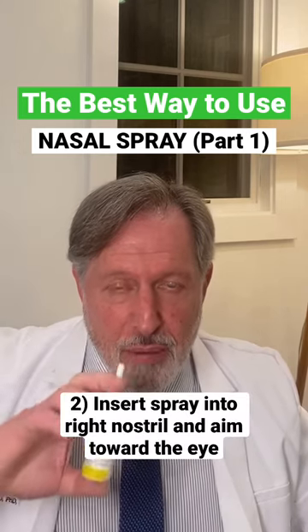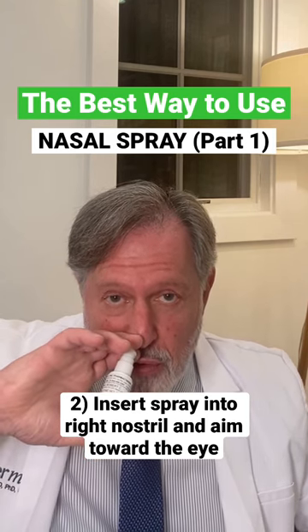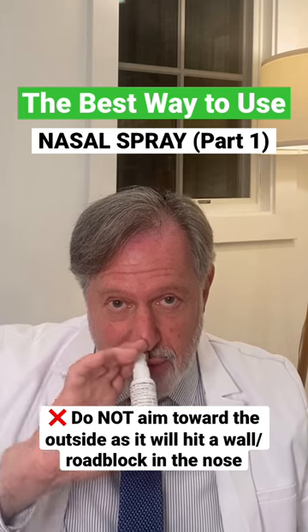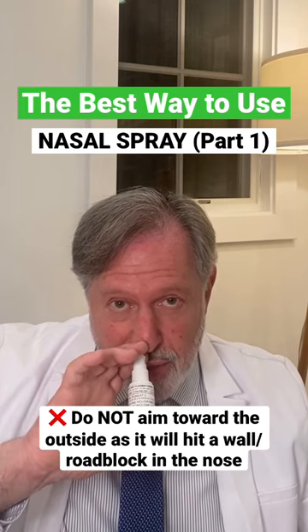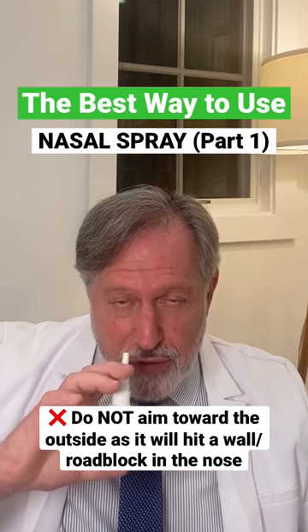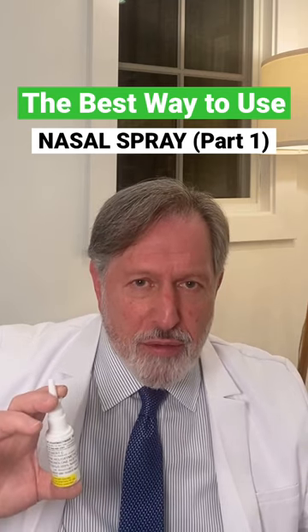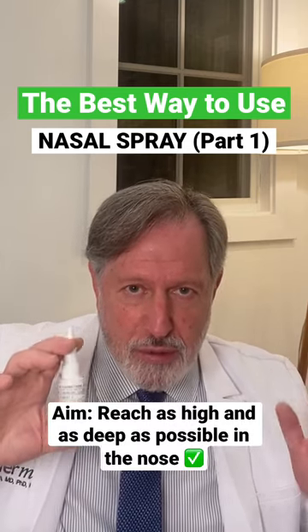I'm seated. I'm going to insert the spray into my right nostril as high as comfortable, and I'm aiming toward my eye. You're not aiming toward the outside, as you might read in the instructions of a number of nasal sprays that say to do that. In our view, doing so causes the spray to hit the wall, to hit a roadblock. Our aim is to allow the spray to reach as high and as deep as possible.